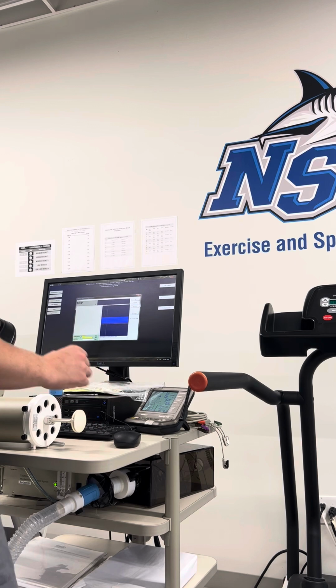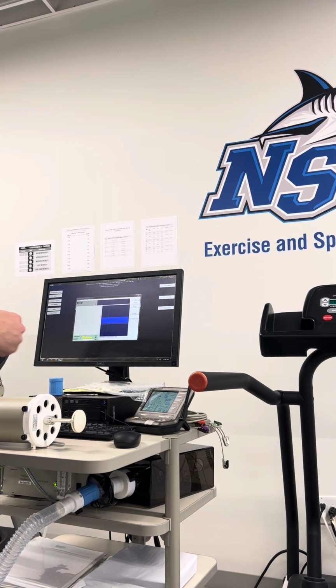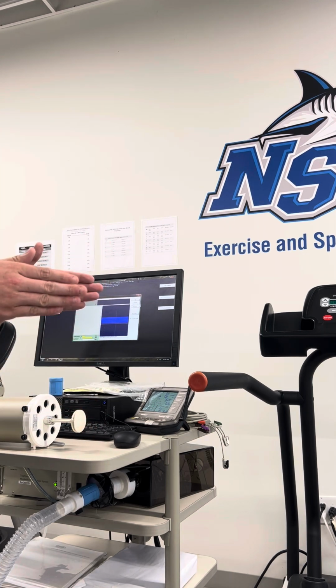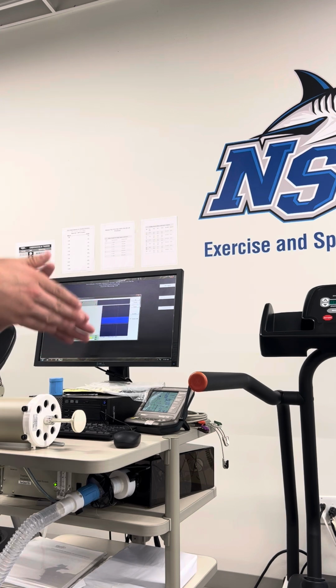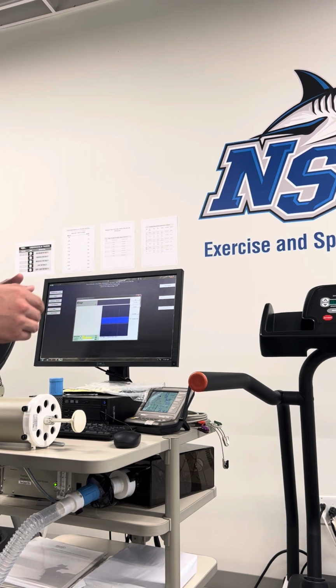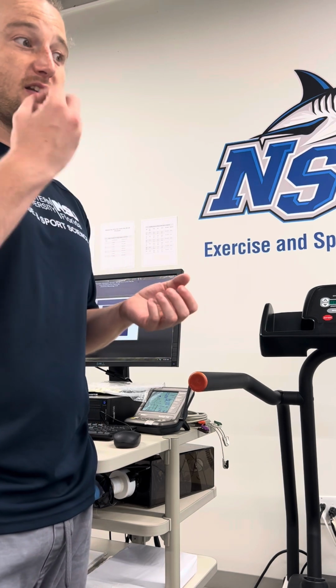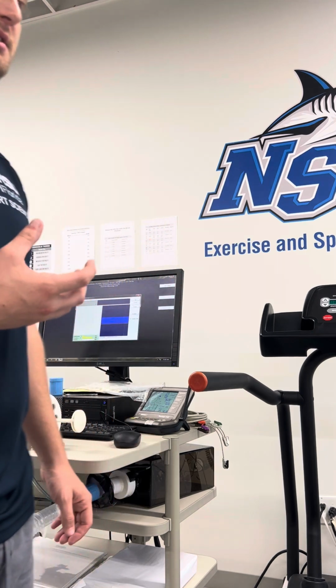Okay, now I have 5 strokes. There's 2 methods to do this. One method is to try to get the same stroke peak every time. That'll prepare you well for an RMR test or a threshold test even. If you're looking for something like a VO2 max test or even a threshold test, you could do this as well. You want to start with stroke peaks of 50 to 100, then work up to 100 to 200, 200 to 300, 300 to 400, and then one last big pump of the syringe. And this helps the system prepare for the demands of a VO2 max test, which is going to be taking in a lot of air and heavy labored breathing.